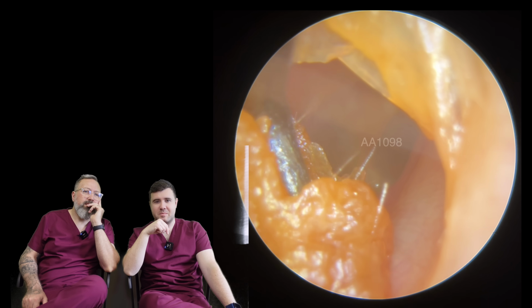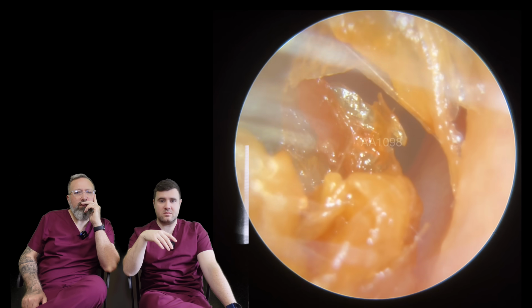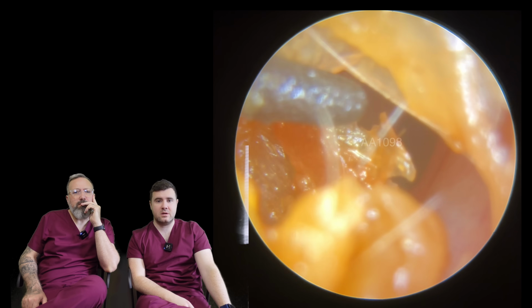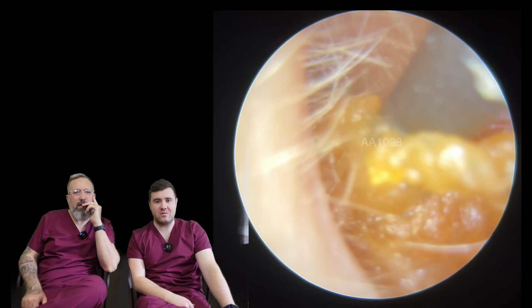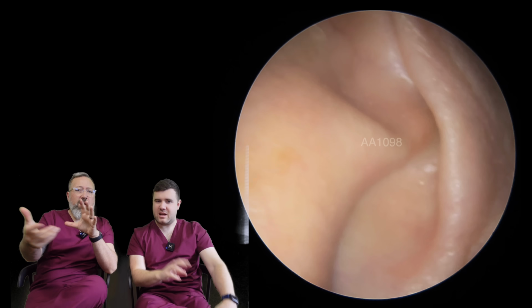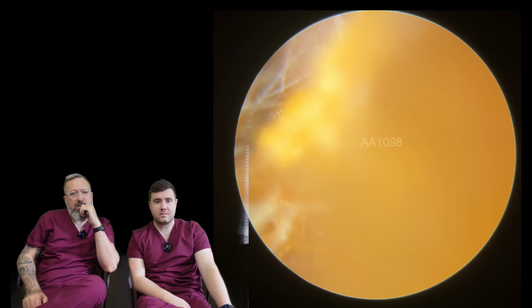Yeah, trying to nip into that gap, get into the wax. Not quite as full this side, but we thought, it's got to come out anyway, because that's only going to get worse. It's only going to go further back. So, you can see where it's all moving. It's quite loose, this one, quite freely moving. Oh, there we are. Wow, that almost unraveled and folded there, didn't it? Look at that. It almost concertinaed on itself.